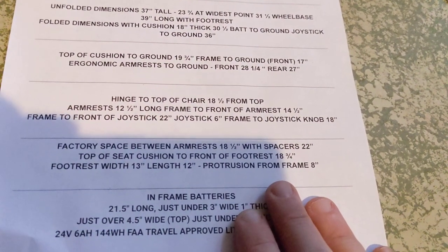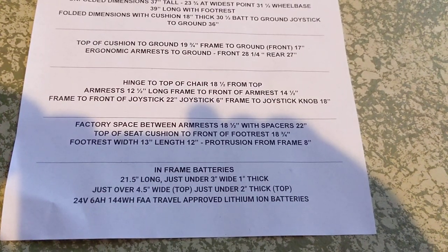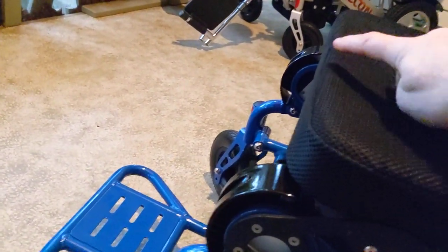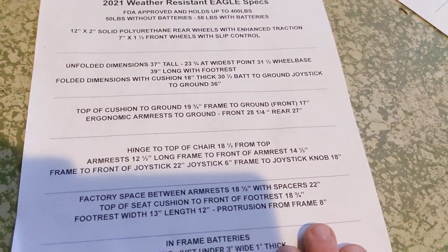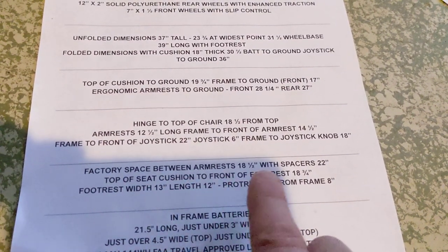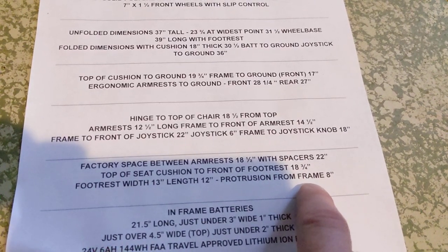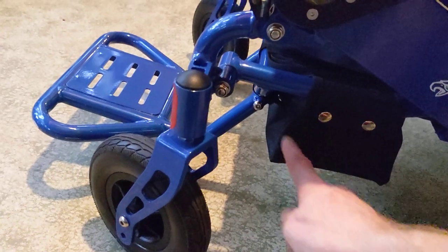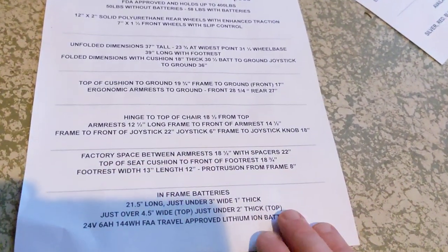Factory space in between the armrests is 18 and a half inches. With the spacers, you can space it out to 22 inches. Top of the seat cushion to the front of the footrest is 18 and three-quarter inches. Footrest width is 13 inches, the length is 12 inches, and the protrusion from the frame is 8 inches — so 8 inches of the footrest actually protrudes from the frame, which is important to understand.